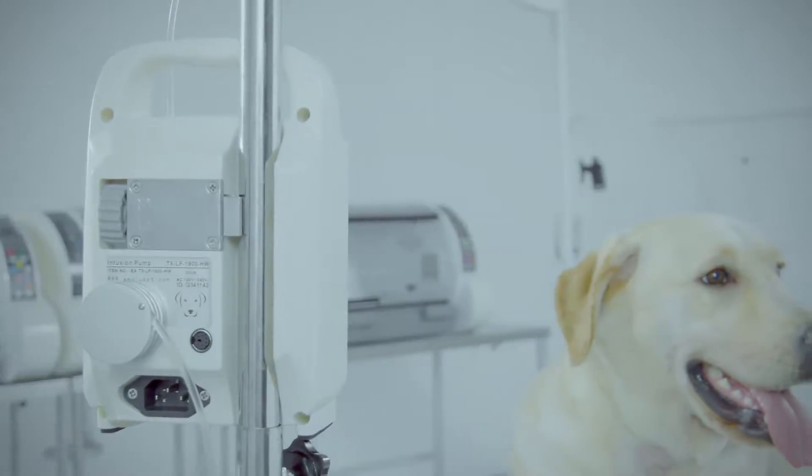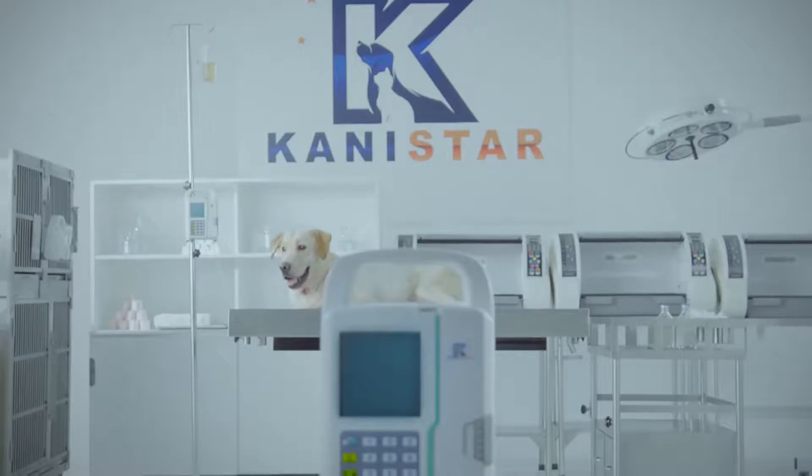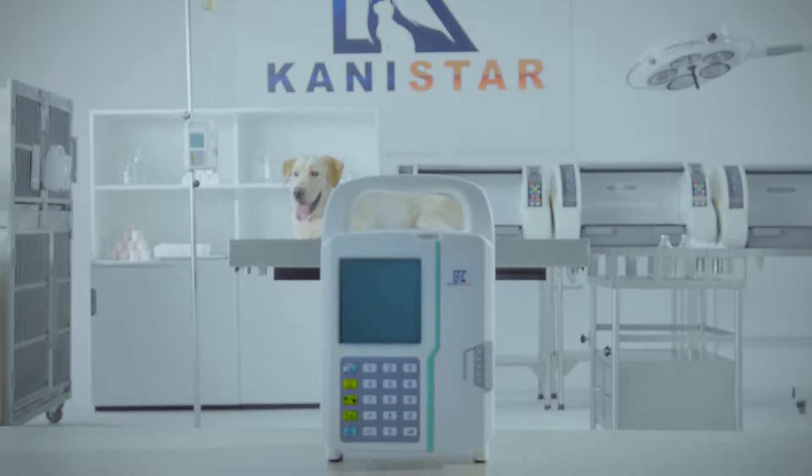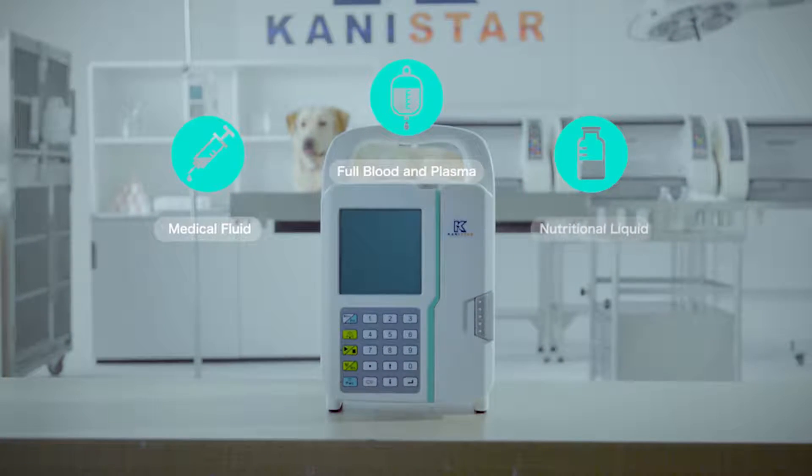This new technology also reduces damage to nutritional molecules, which makes it a good enteral nutritional pump. With this unique feature, the LP1900 is a real three-in-one pump, capable of delivering medical fluid, full blood, plasma, and nutritional liquid.